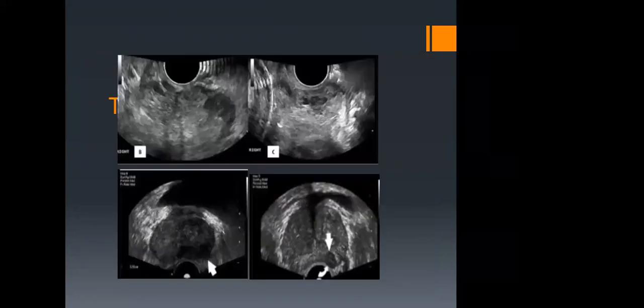So, ladies and gentlemen, I'm emphasizing the appearance of these lesions transrectally. It is very easy to pick even the smallest and tiny lesion transrectally compared to transabdominally. Let's change our approach. The area where we detect these small lesions is the area where we are going to prevent the prevalence and the costs of managing these cancers.